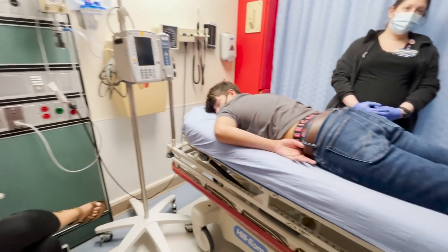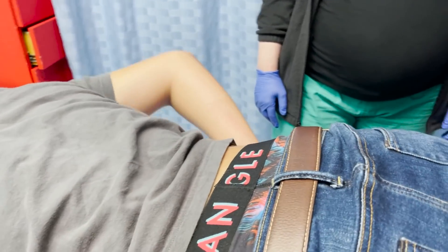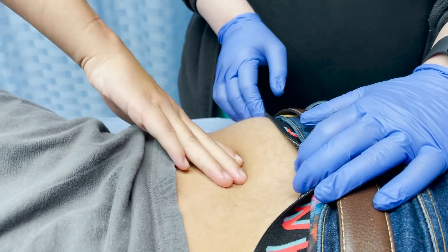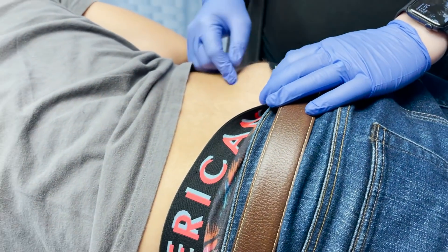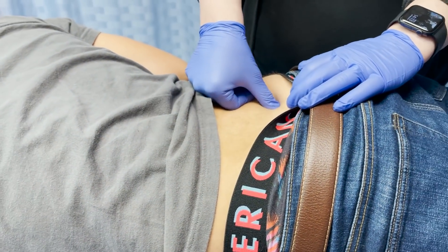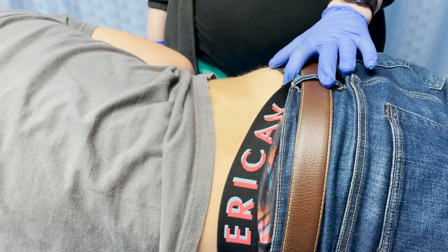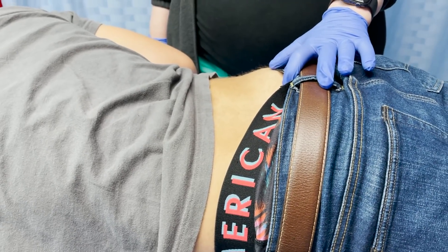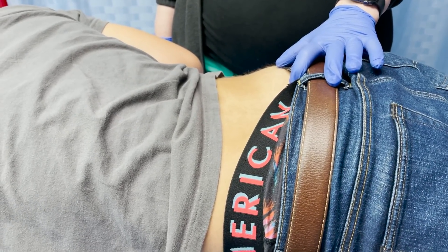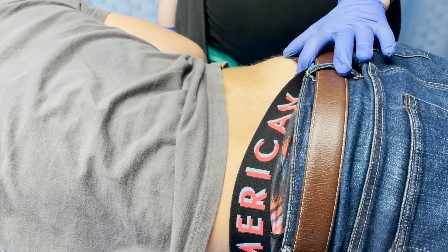When we localize it, we find it with a single finger — it's at these dimples that are attached to a ligament in the sacral area. Can you show me exactly where your pain is? Okay. So that's where we're targeting.